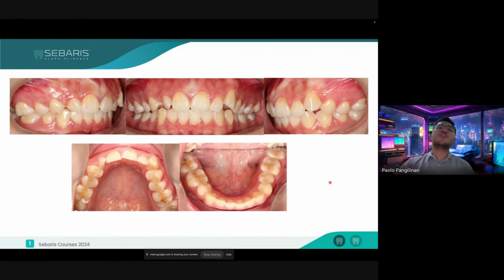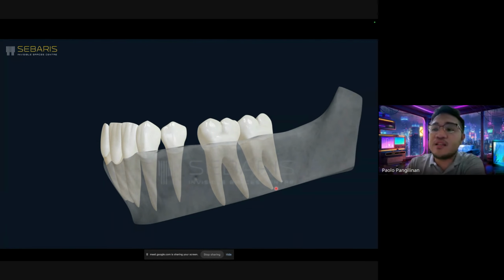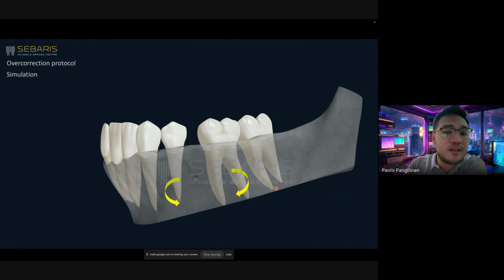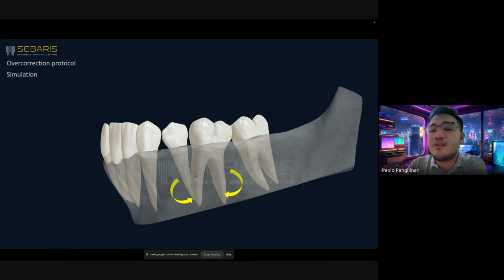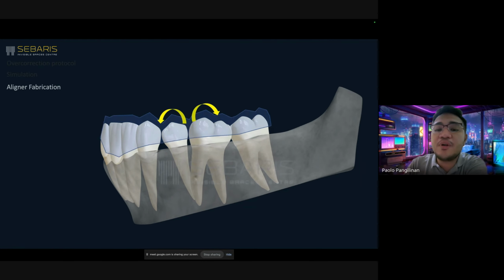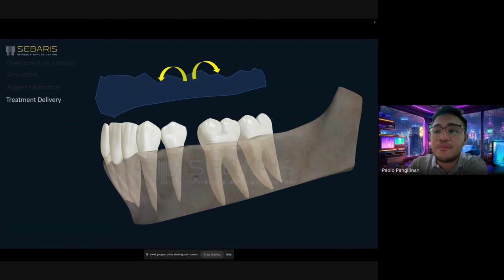Okay. Another action of your auxiliaries, for example, is, you're gonna do extractions, just like in this case where we have an asymmetric extraction and we're looking to symmetricalize the whole thing. So what we're gonna do here is perhaps we're gonna utilize pull mechanics together with push mechanics to make sure that it actually moves in simulation. So we've added programming.